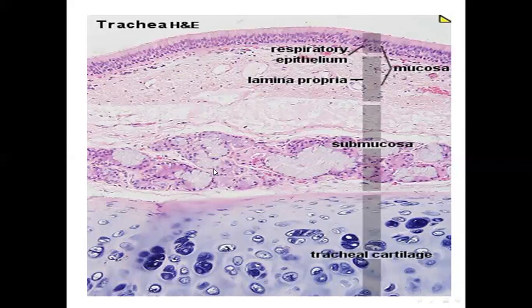هنا هذه الطبقة. بعدها تجي عندنا طبقة هذه طبقة اللي that's including with it the cartilage الهايلين cartilage. طبقة نسميها الادفنتيشيا اللي هاي الاكسترنال. تمام. Adventitia composed of fibroelastic connective tissue.